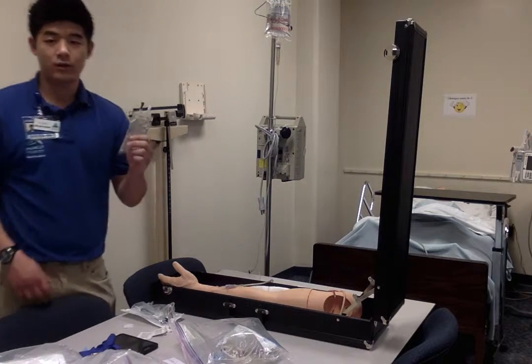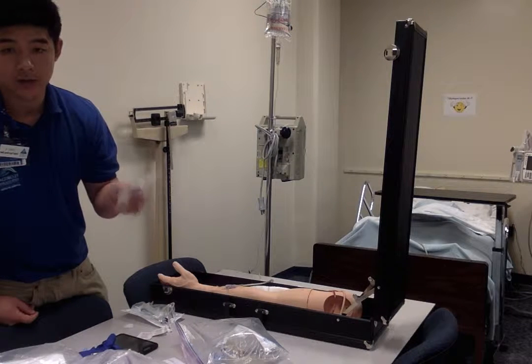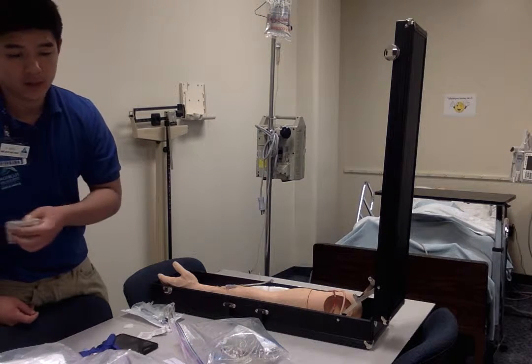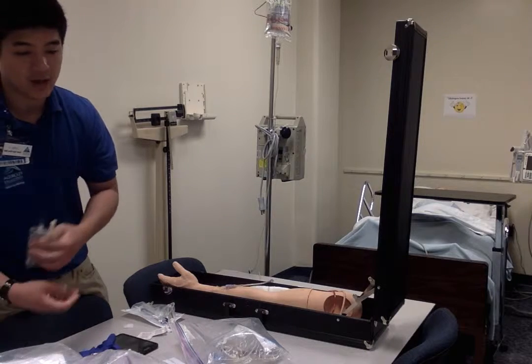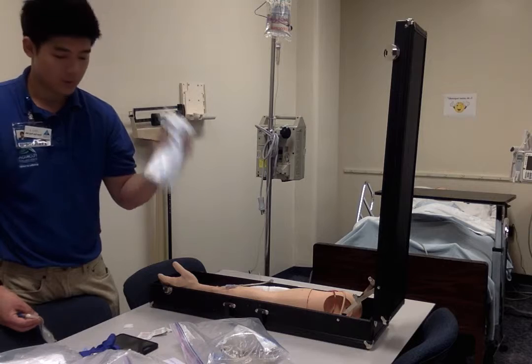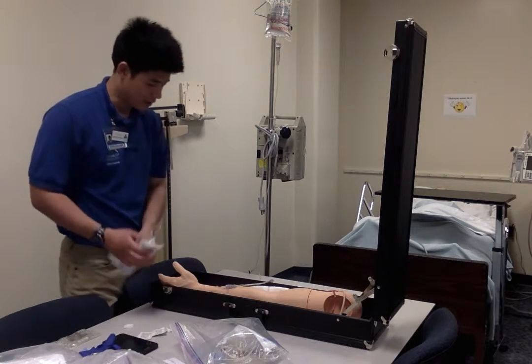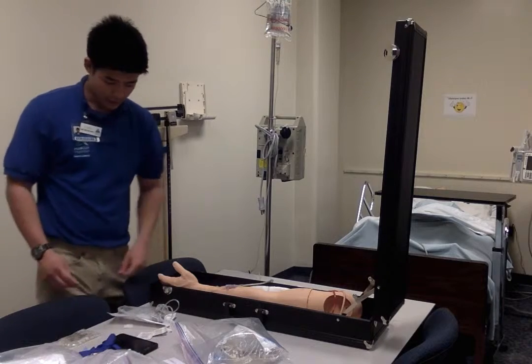Make sure you label your medication with the right medication, dosage, the patient's name, date, time, and initials. Also, with the tubing: date, time, initials, and that's right.